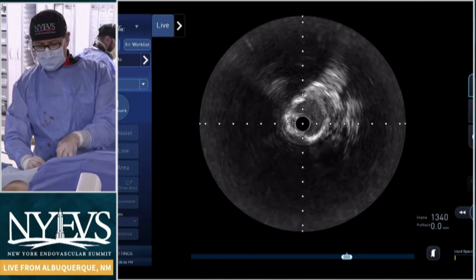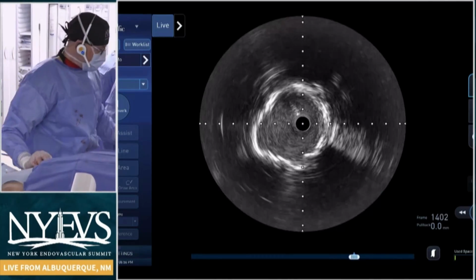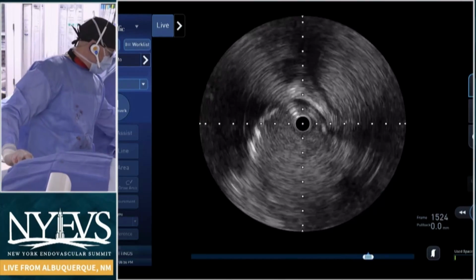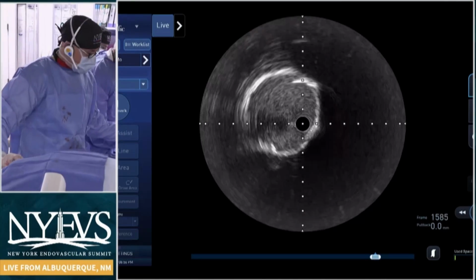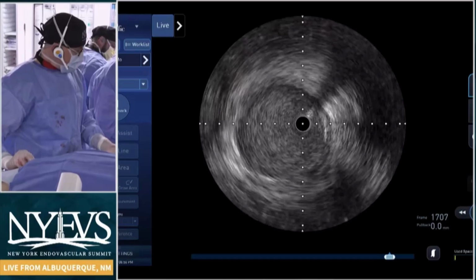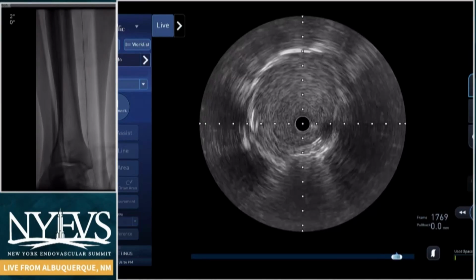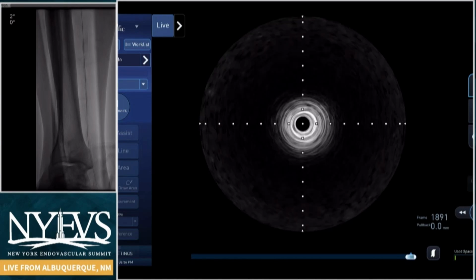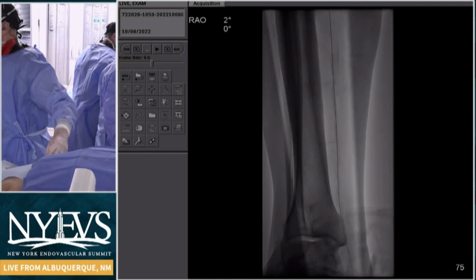Yeah, so I agree with the Diamondback. I'm taking a 1.25 micro, and I'm using a little bit of faith on that IVUS because, truth be told, I wasn't even able to get the IVUS 100% all the way down into the ankle as I had intended.